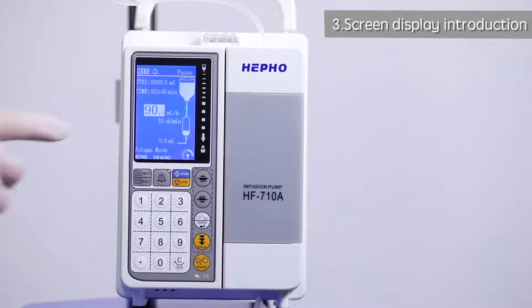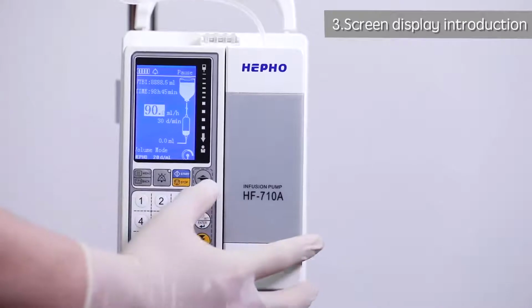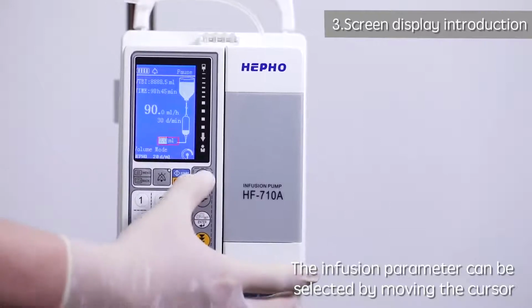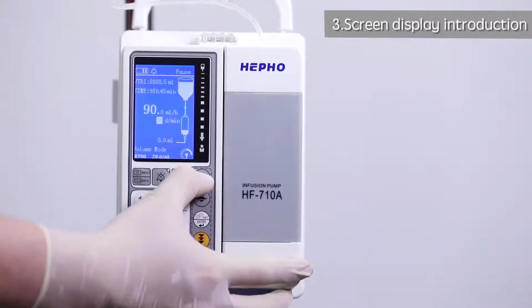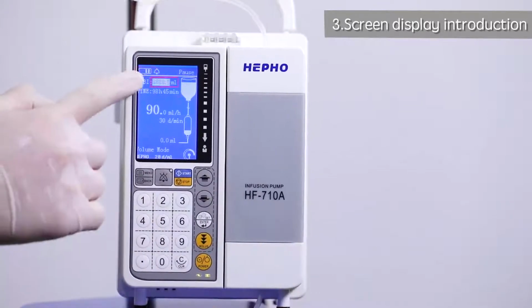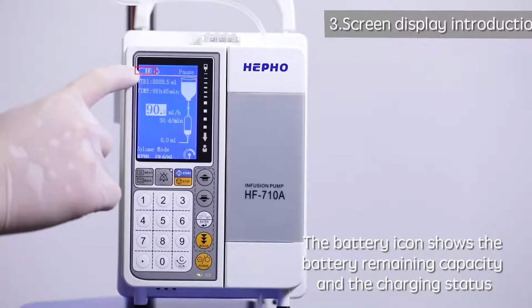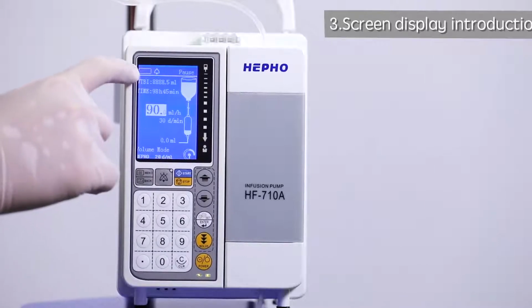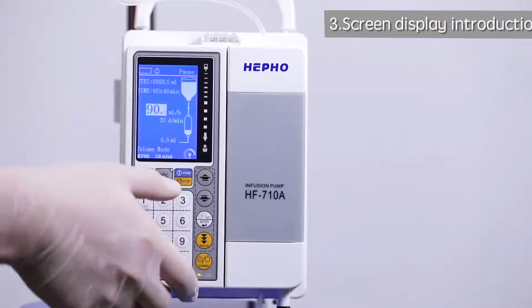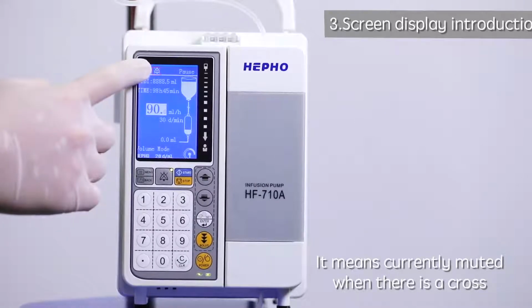3. Screen display introduction. The white square is the cursor. The infusion parameter can be selected by moving the cursor. The battery icon shows the battery remaining capacity and the charging status. Trumpet icon. It means currently muted when there is a cross.